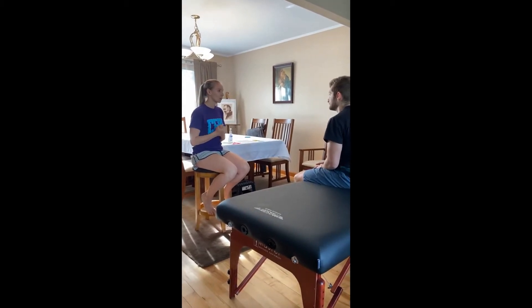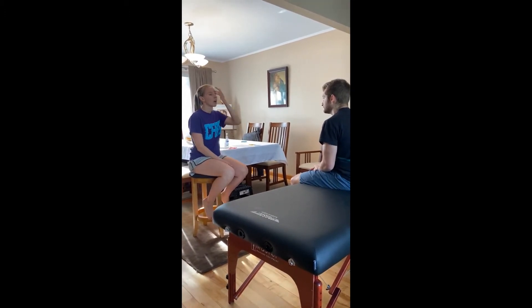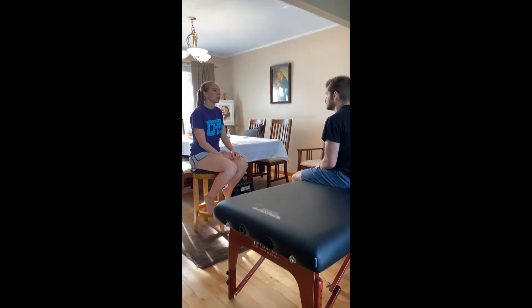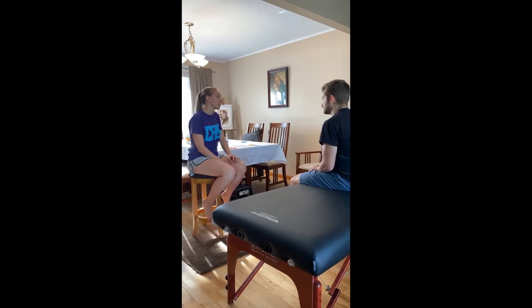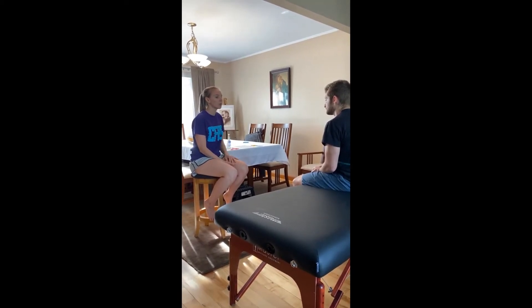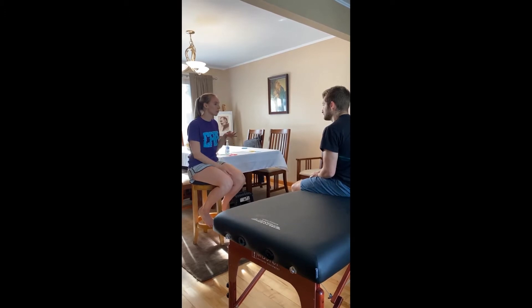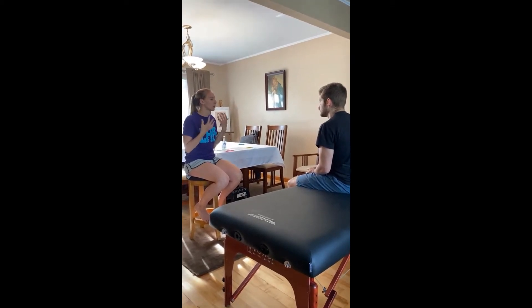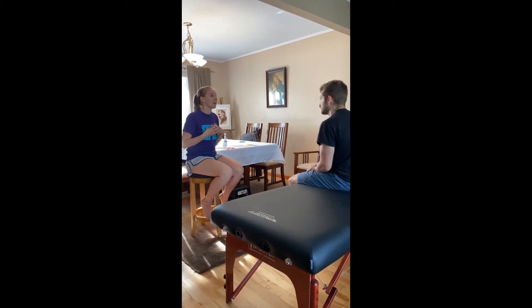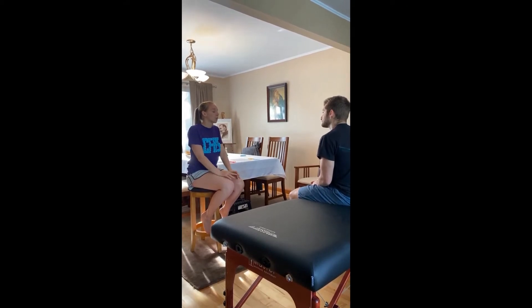I know that you ran a marathon recently and you had a right hamstring strain on that medial side, correct? So what we want to do today is help with pain relief. What is your pain right now on a scale of one to ten? About a six. So I want to try an IFC, an interferential current. I have these electrodes hooked up to a machine and I'm going to place four electrodes on you — they have two channels. These two channels cross and cause this interferential current, which creates a non-noxious tingling sensation that causes decreased pain. Would that be something you want to try today?